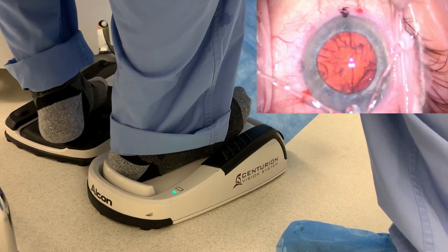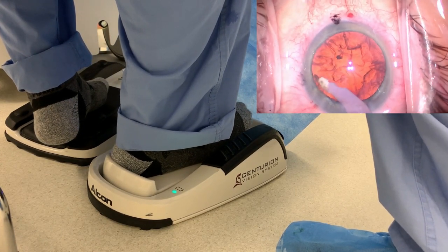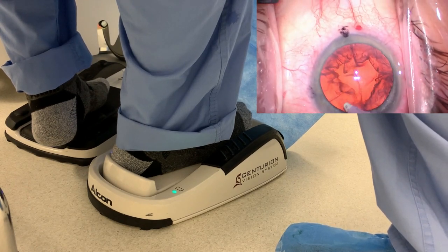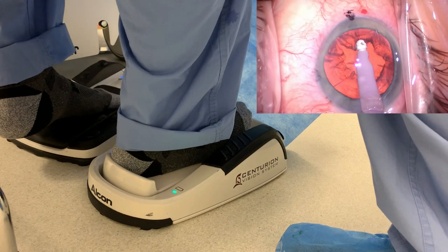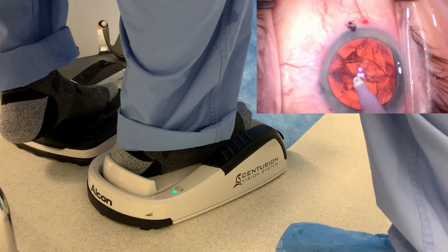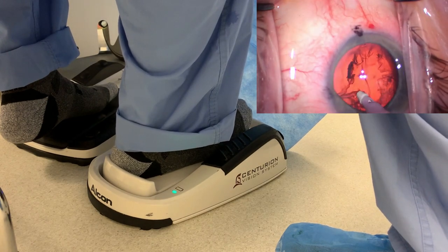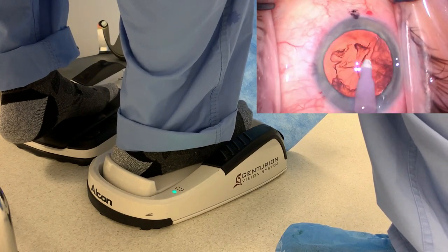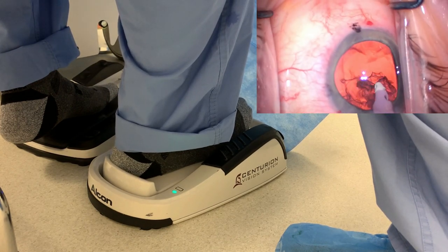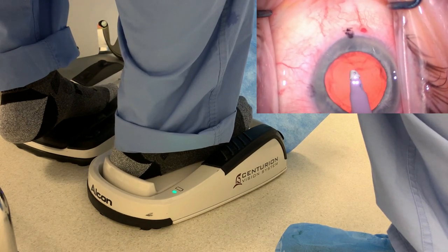Now we've got the I/A probe coming in — stepping on position one. Now there's more vacuum going in the eye. We can really give it some vacuum to get that piece down. During cortex removal, I'm really stepping on the pedal into position two for most of it. I'll retract a little bit at a time, but I'll never go just to position one when removing the cortex — there's no benefit, we want the vacuum. We're just titrating the level of vacuum by just a few millimeter movements of the foot at a time.